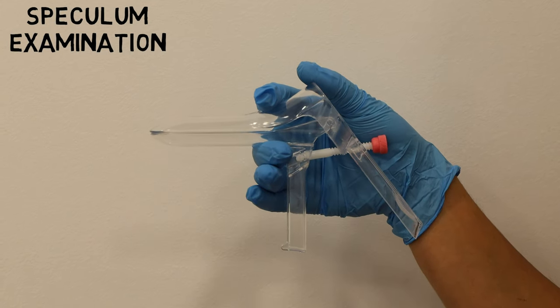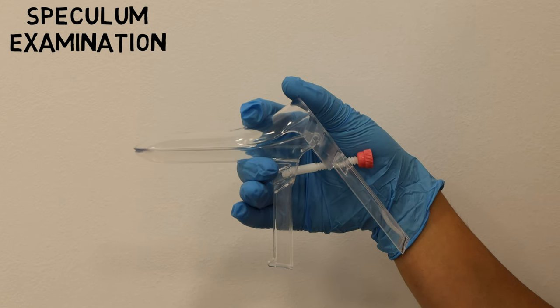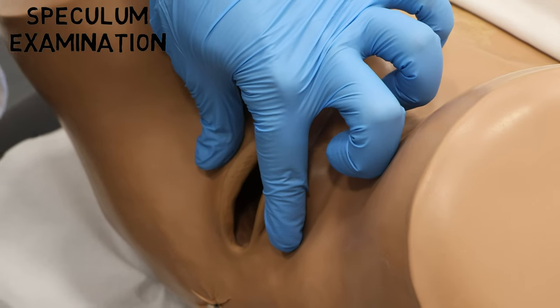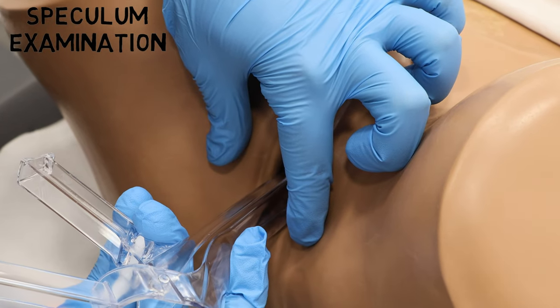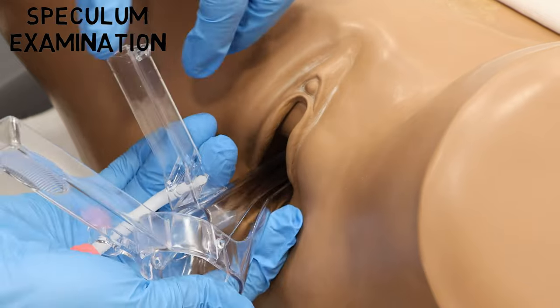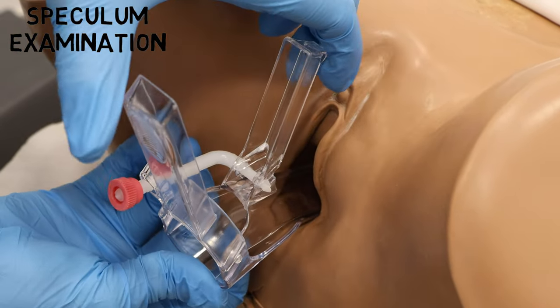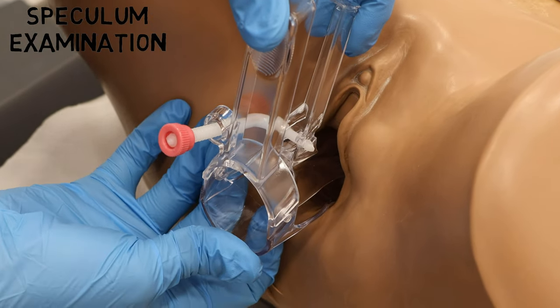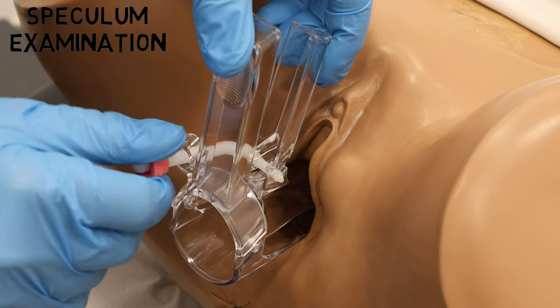Now we'll look at how to insert the speculum. On an actual patient, we'll need to lubricate the blades of the speculum, then part the labia, insert the speculum on its side slowly with the blades closed, and then rotate the speculum with the handles positioned at the top. I prefer this approach rather than having the handles facing downwards and having to fiddle with them close to the anus.